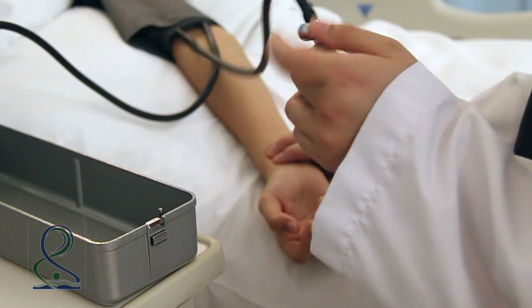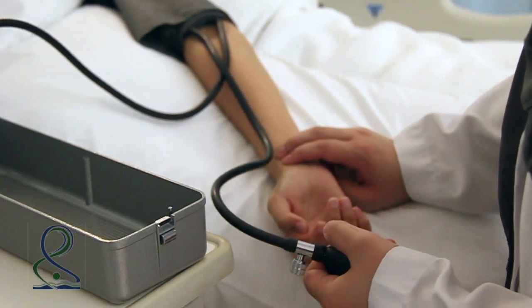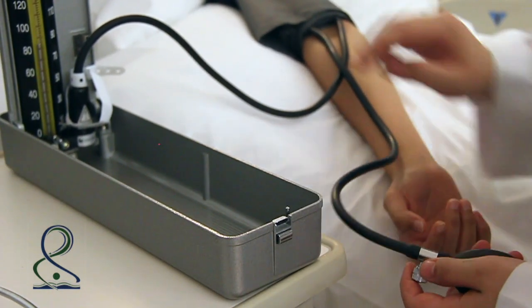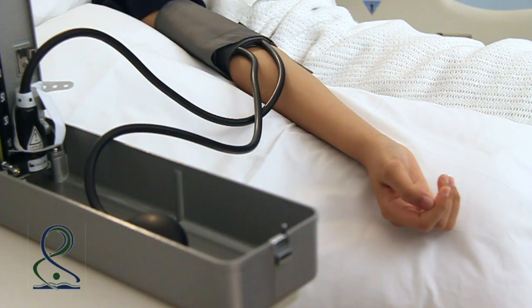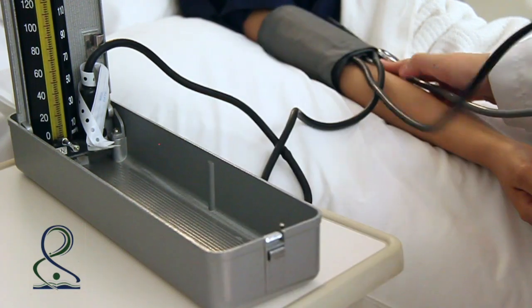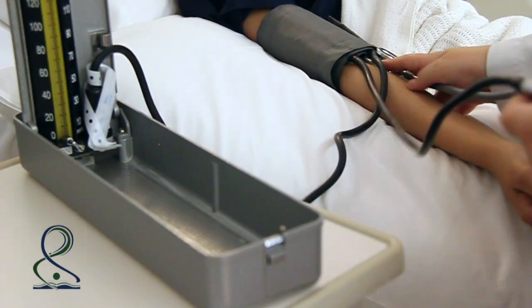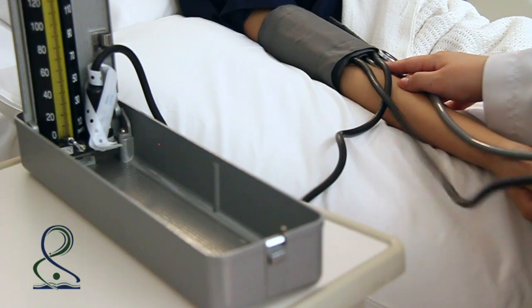Close the valve on the sphygmomanometer pump and inflate the cuff rapidly while palpating the radial artery until the pulse is no longer felt. Note the level and rapidly deflate the cuff. Wait 15 seconds before obtaining the blood pressure measurement. Position the stethoscope earpieces in the ears and place the bell or diaphragm of the stethoscope directly on the skin over the brachial pulse.